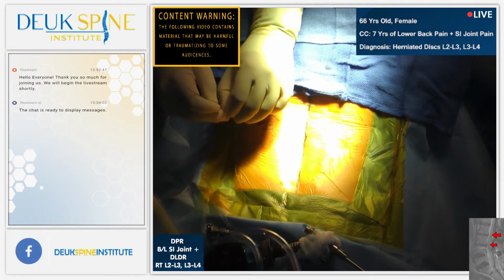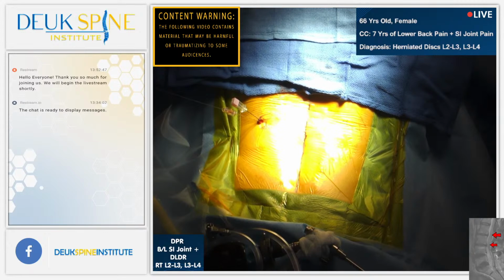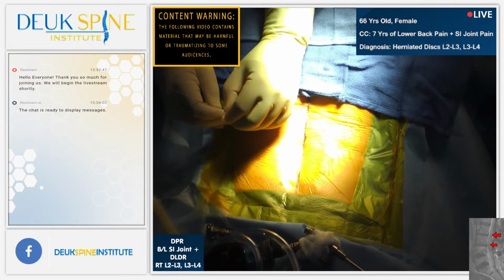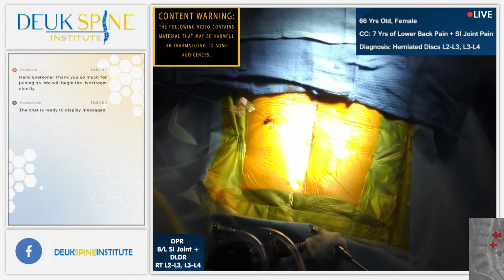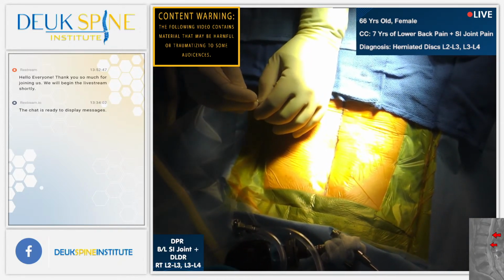Right, welcome back. Now you've had an opportunity to see what does cause back pain, or how a disc causes back pain. And our patient has 2 damaged discs right above her fusion, L3-4 and L2-3. Now I'm not able to get the 3-4 needle in, but I'll get it in later. But we are able to get the 2-3 in.